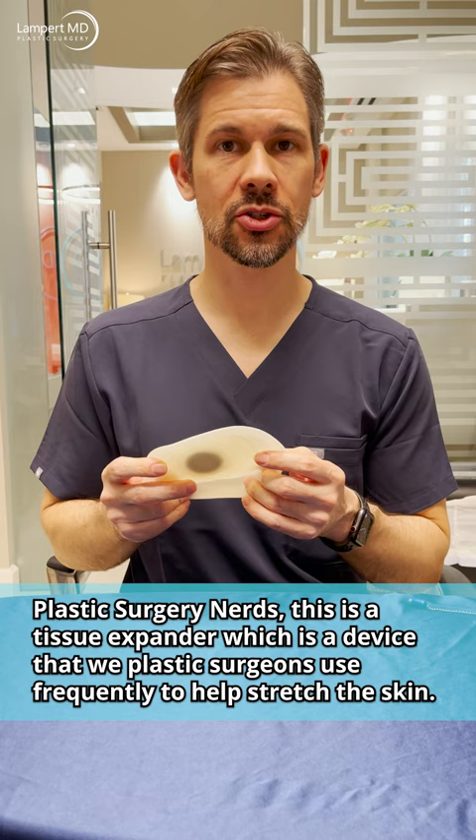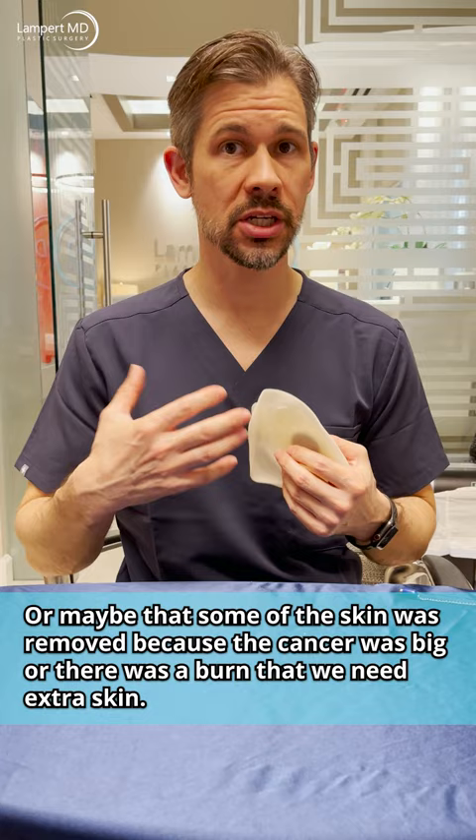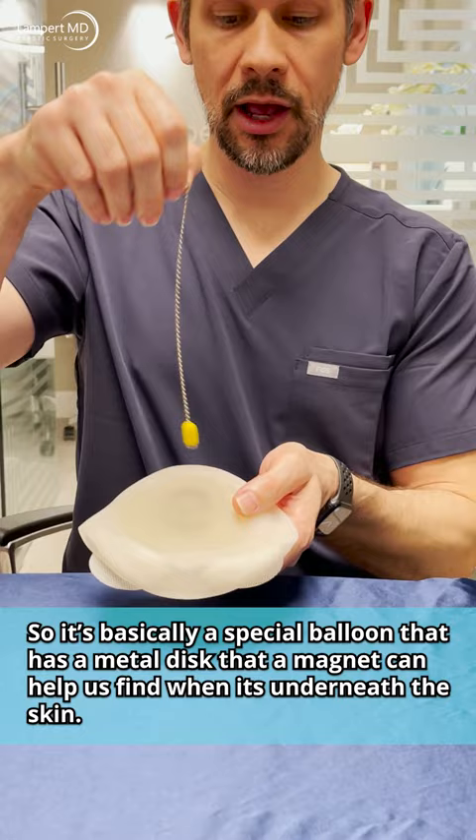Plastic surgery nerds, this is a tissue expander — a device that plastic surgeons use frequently to help stretch the skin. Sometimes we need to stretch the skin to shape it, like in breast reconstruction, or maybe some skin was removed because the cancer was big, or there was a burn and we need extra skin. It's basically a special balloon that has a metal disc that a magnet can help us find when it's underneath the skin.